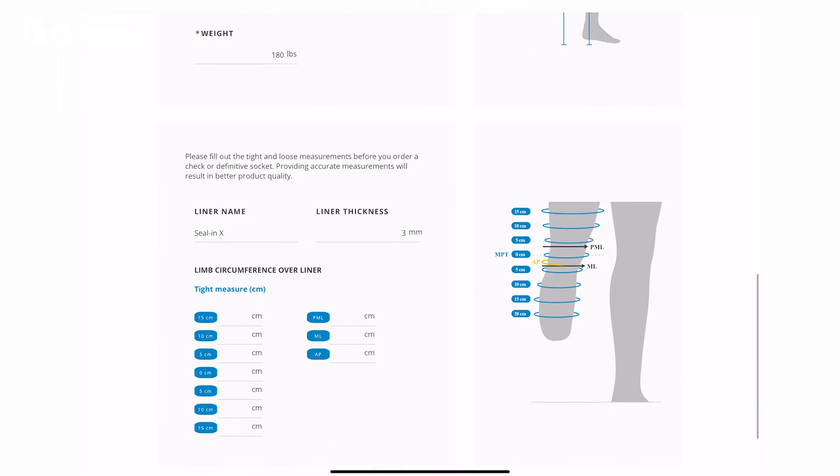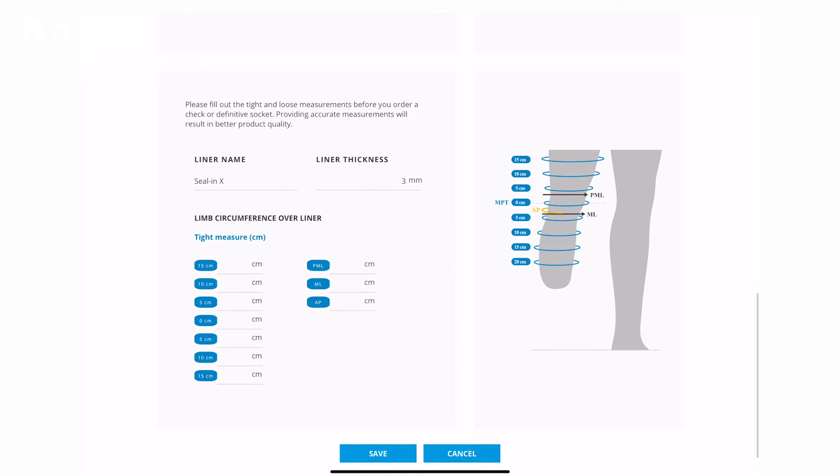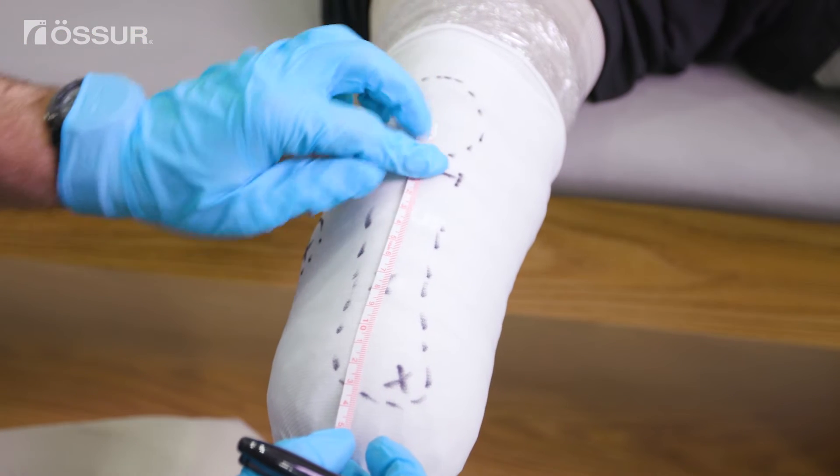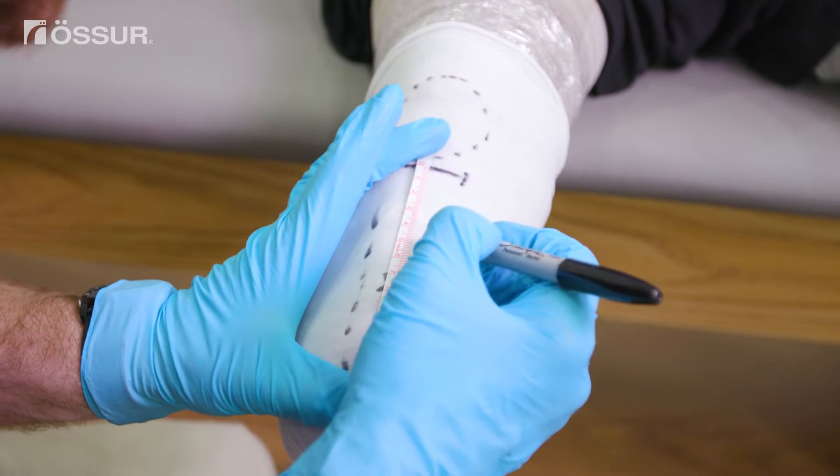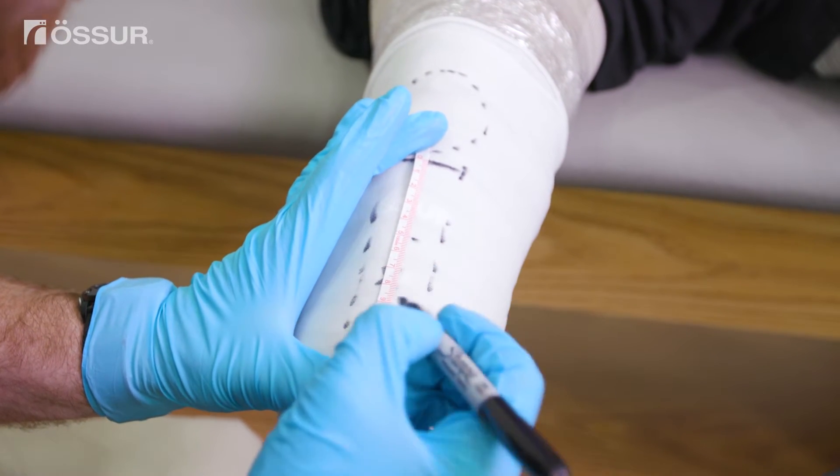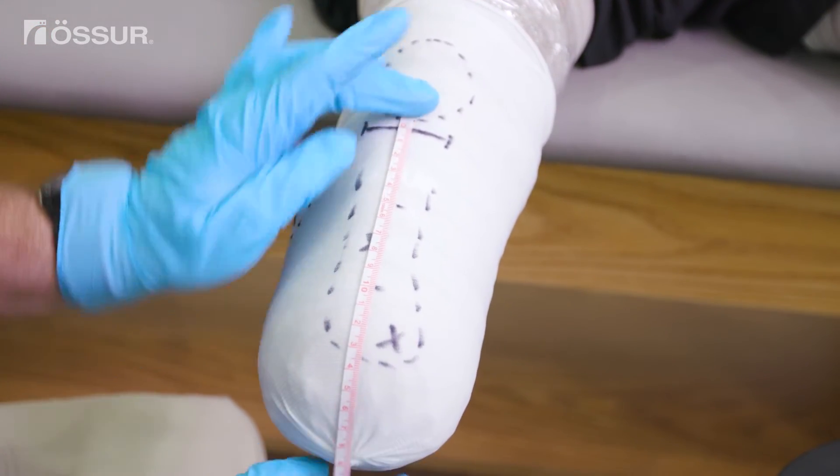The next step is to mark where to take the measurements. Mark every 5 centimeters above and below the MPT as appropriate for that socket design. Then measure the circumference at each of these locations, starting with the MPT.